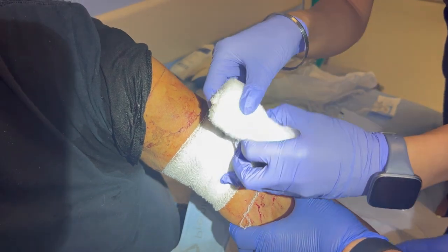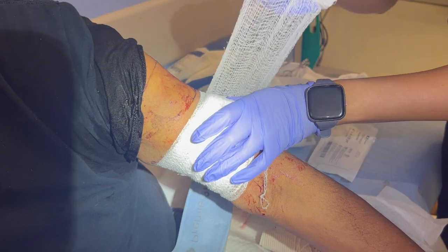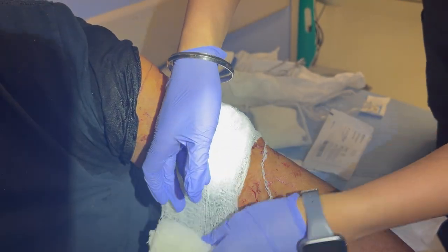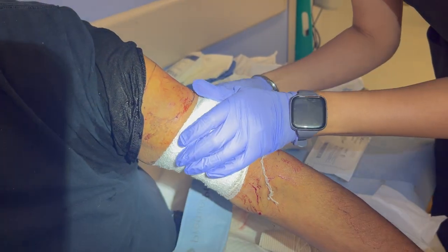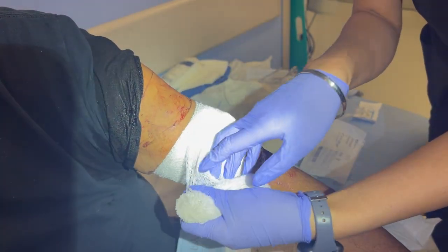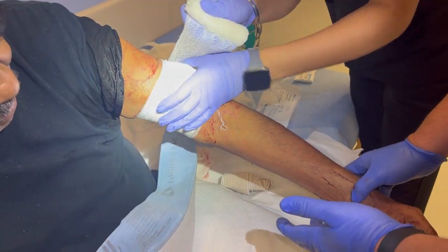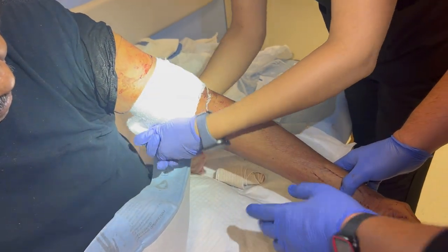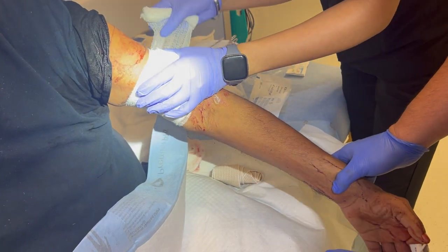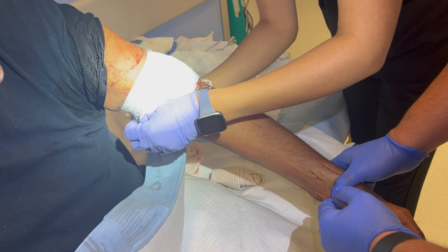It's just a simple matter of wrapping it all the way up and making it look nice. Then we're going to get him moved over to vascular surgery for repair of the fistula. He's got good distal pulses, no numbness or tingling in his arm. He's been a big sport for us — so thanks, Dave, for letting us teach this.